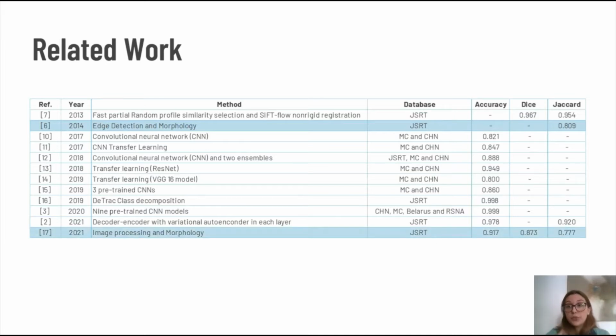In our previous work, we considered the usage of morphological operators applied after binarization. Different from the current method, both Saad and our previous work considered morphological techniques applied only after the binarization of the images. And in the here proposed approach, the morphology operations are used before and after binarization to capture more details of the gray tones and facilitate the region of interest identification.